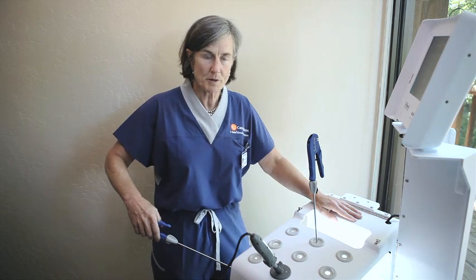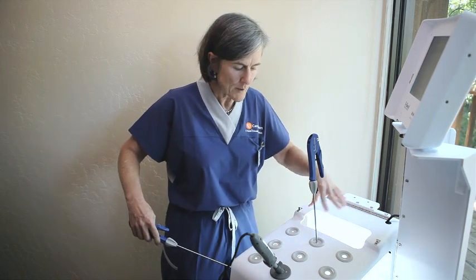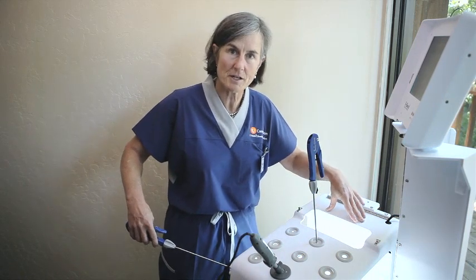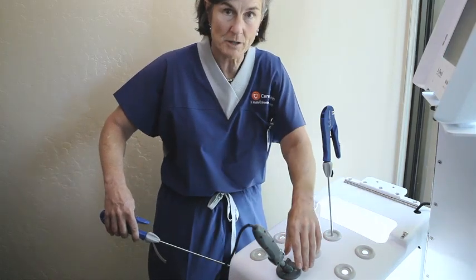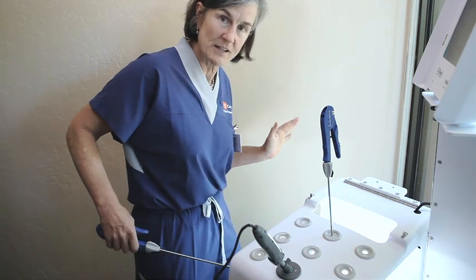I am using the pelvic trainer but I have it situated exactly like the patient is on my operating room table. The video comes through the patient's umbilicus. I am situated on the patient's left.